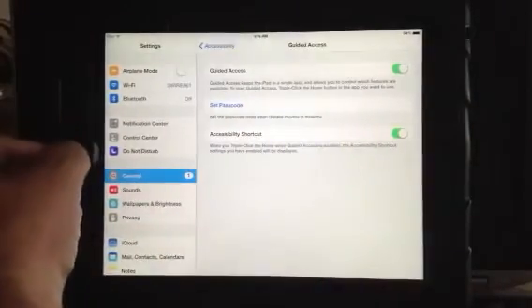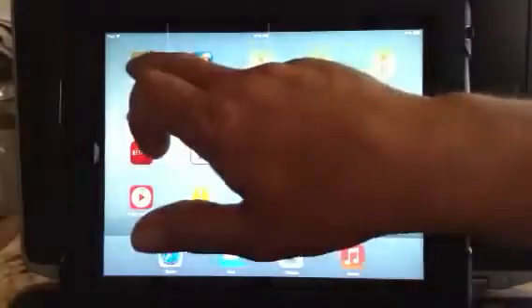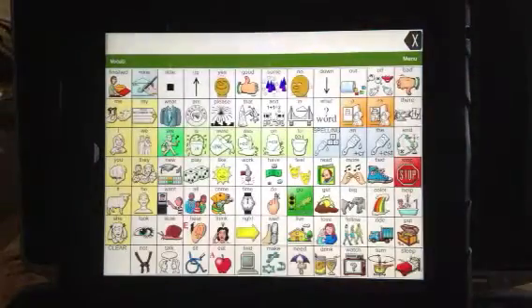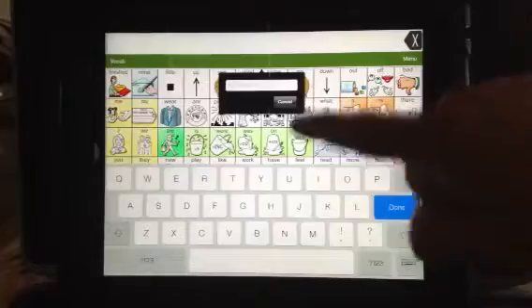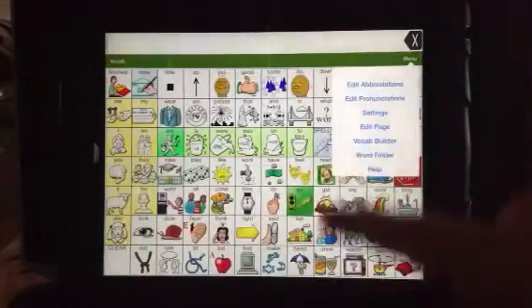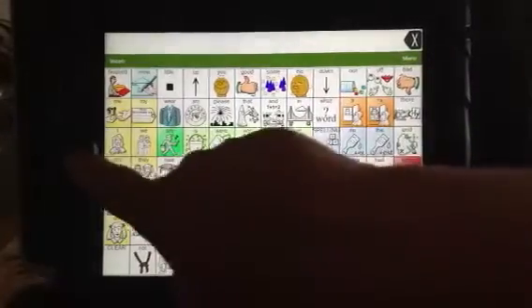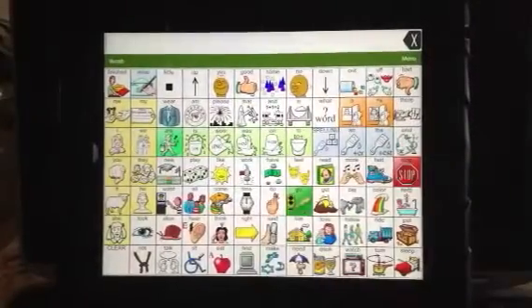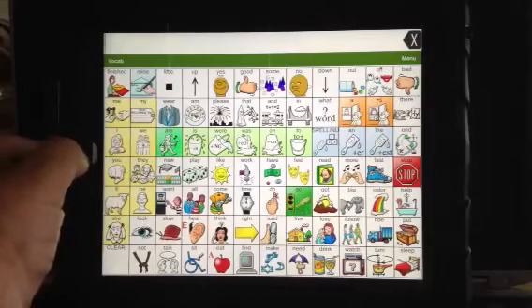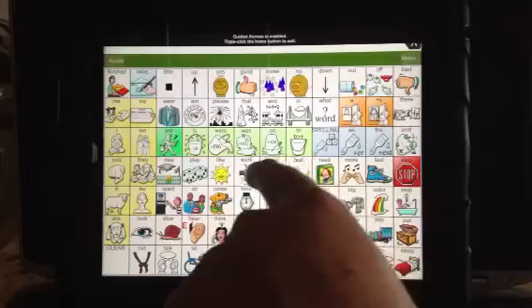Now let's go back to Words for Life and see how to use this. I'm back in LAMP Words for Life. I don't want the child touching the menu, getting to the vocabulary, or hitting the Home key to get out. So now I'm going to touch the Home key three times fast — and it says Guided Access has started. It was that quick.